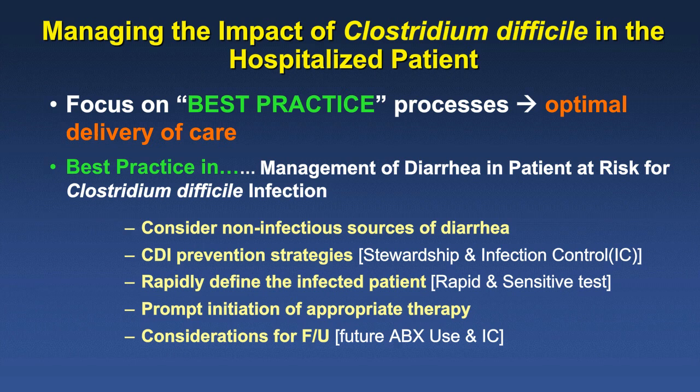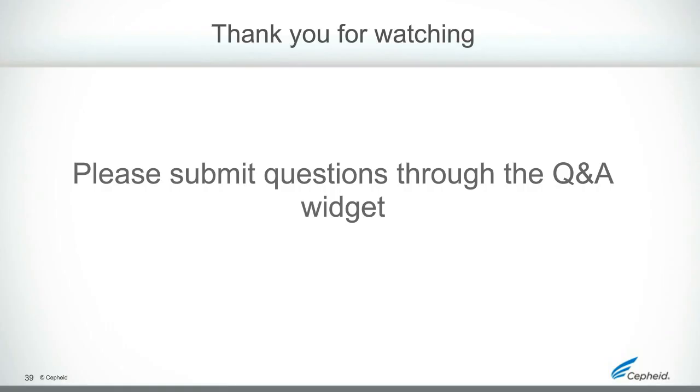Yeah, so we are currently a standalone PCR approach, and again, at some point, I forget the actual time that we made that change, but we had a two-tier approach with a toxin-based approach. But again, there was a need for increasing confirmation of those tests that did not provide definitive endpoints, and the decision was made to just make a transition to PCR-based approach.